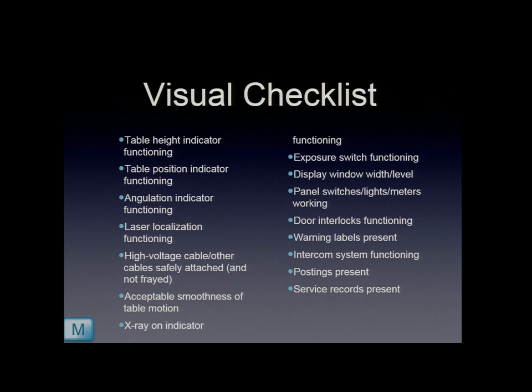Some places have door interlocks that they want to prevent an exposure if somebody walks in. Frankly, I think the exposure of that person is worth it for them just walking in blindly anyway, than having to repeat it on a patient. So I really don't recommend interlocks on doors for CT, because you have to repeat. If somebody just put in contrast media and they're acquiring a run, and then all of a sudden the machine shuts down, now you've got contrast overload as well.